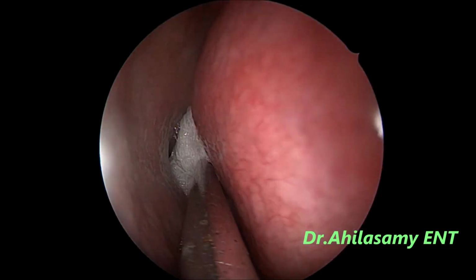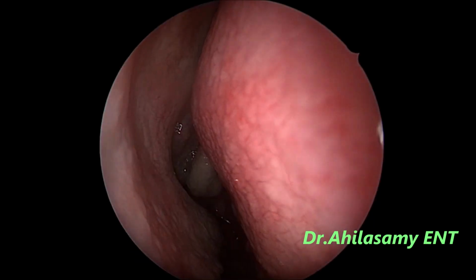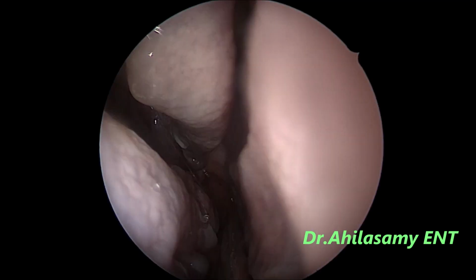Repeatedly pack and decongest both the nasal cavities. Now, after decongestion, you can do the endoscopy. You can see polyps in the middle meatus on the right side also.